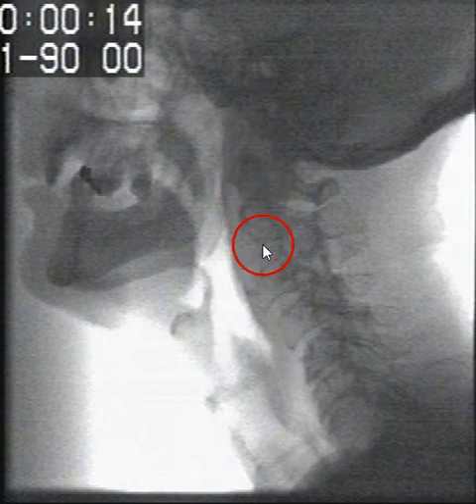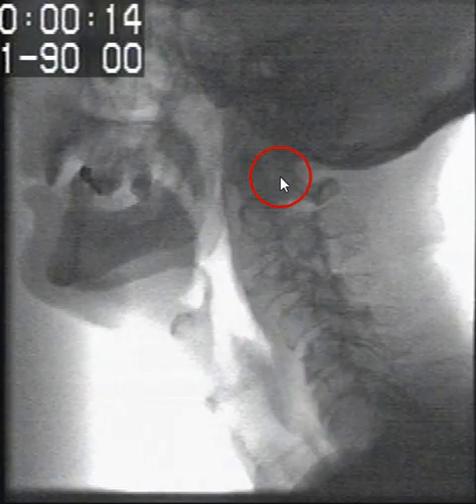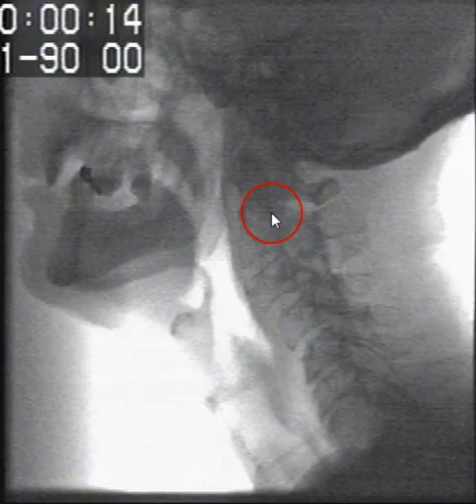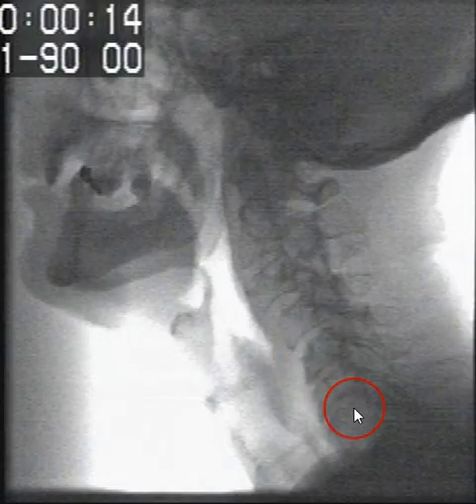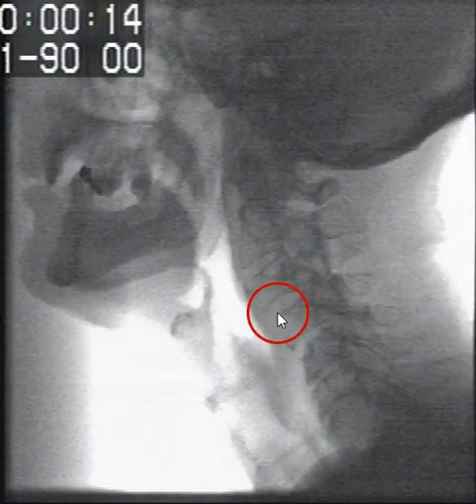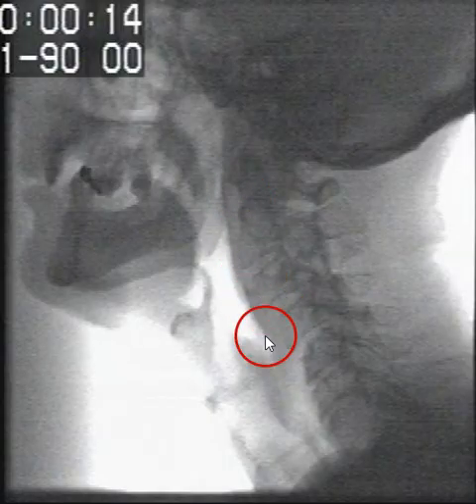We also need to look at the cervical vertebrae. We have the atlas and axis, which are the first and second vertebrae, and then the third, fourth, fifth, sixth, and seventh cervical vertebrae. We need to rule out any osteophytes at the beginning of the video fluoroscopy procedure.